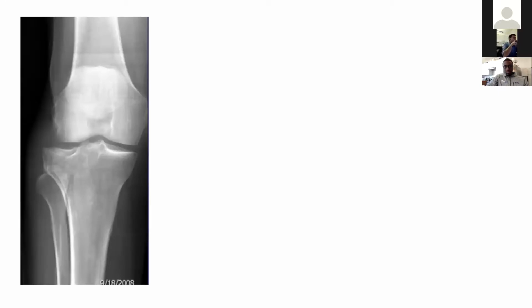Okay, somebody talk to me about the lateral plateau findings in this one. Who should I call? I'm sorry, I don't really know all you guys. Let's go for a 2. Okay, this is Sarah, I'll talk about it. I think what you see here is a split with a metaphyseal exit point with some depression as well. I think there may be 2 exit points actually, so 2 lateral plateau pieces with some depression.